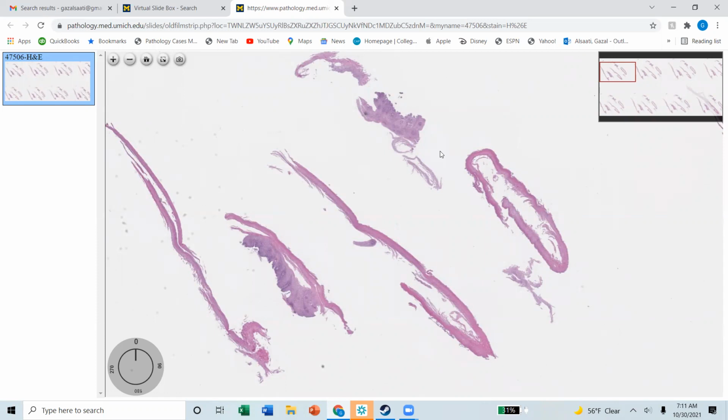first of all, the paperwork that comes with the case, you will look if the patient has dysphagia, pain. What did the clinician see? He will tell you that I either see white plaques, or I see friability of the esophagus, red erythema. So there are some hints telling you that this esophagus is not completely normal.